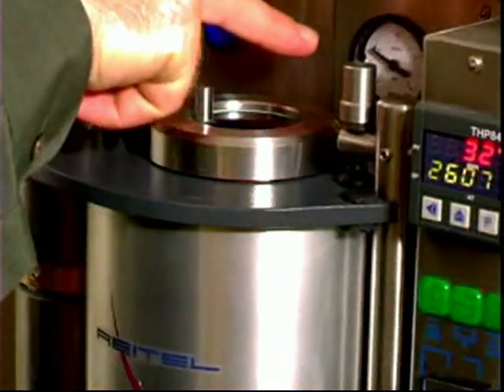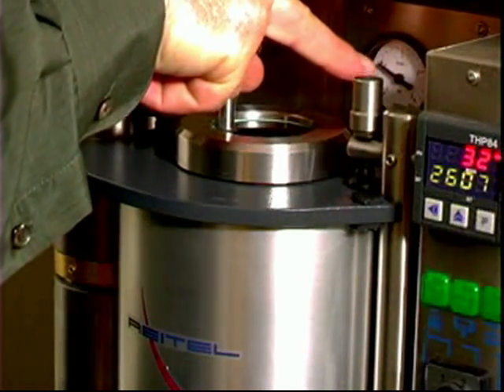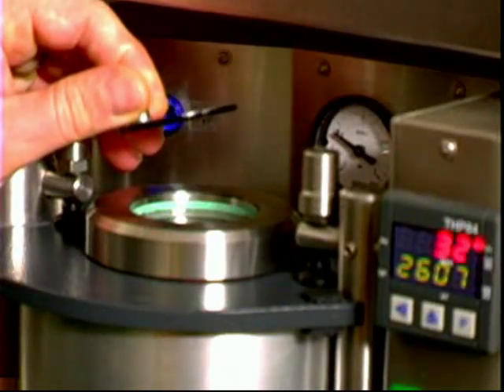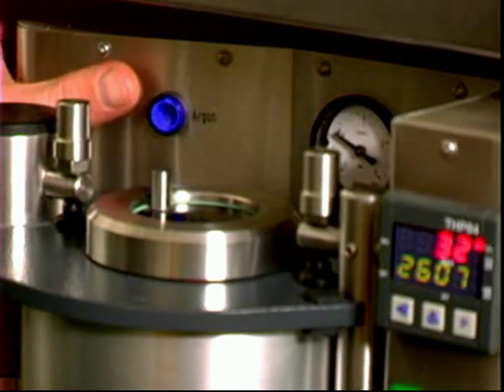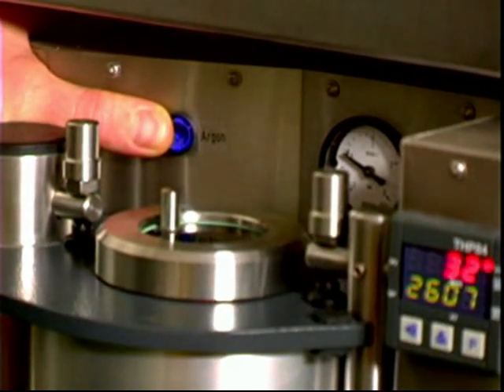This is the pressure gauge. It shows you vacuum and three bars of pressure at stage 3. Remove the glass here to watch the alloy melt. This is the argon flush button. You can use it to cast in an argon environment.